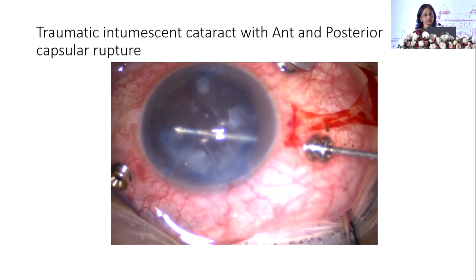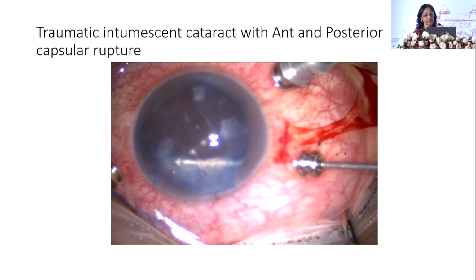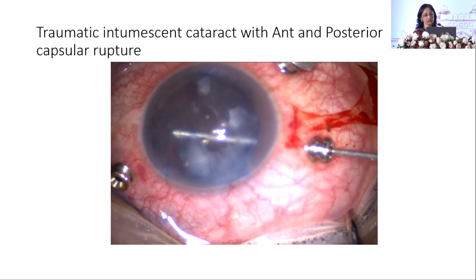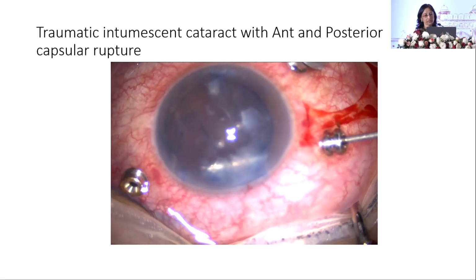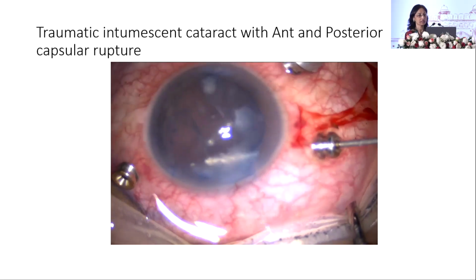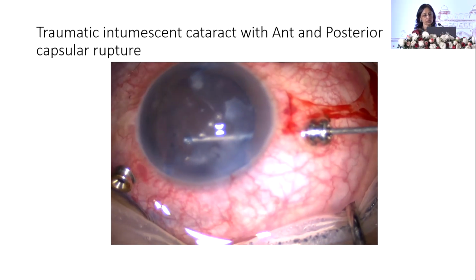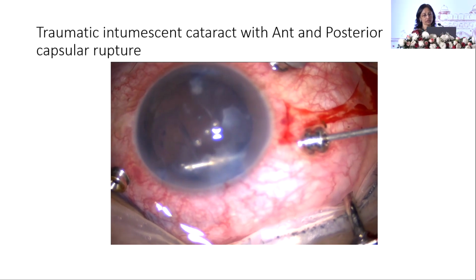You just do the vitrectomy wherever you feel that now the vitreous is clear, switch to the aspiration mode, do the aspiration, and wherever again the vitreous is there, switch to the cutting mode just by changing the foot switch position. And this way, slowly and slowly, we remove whole of the cortical matter.